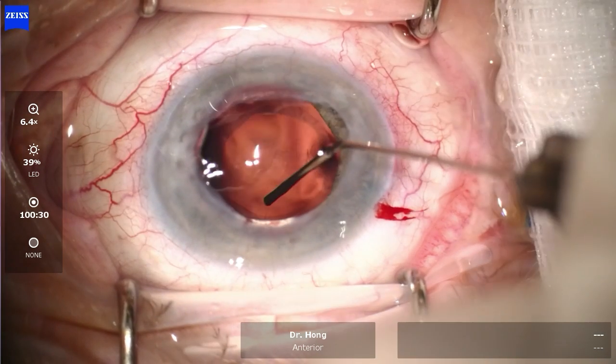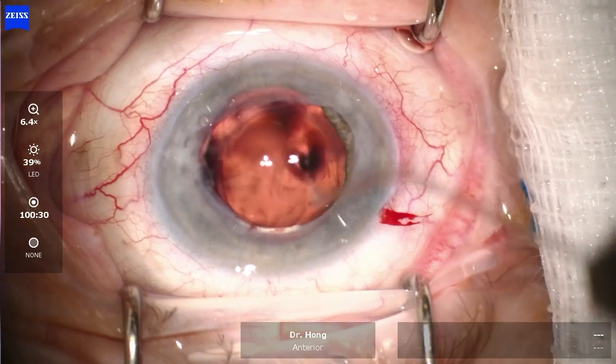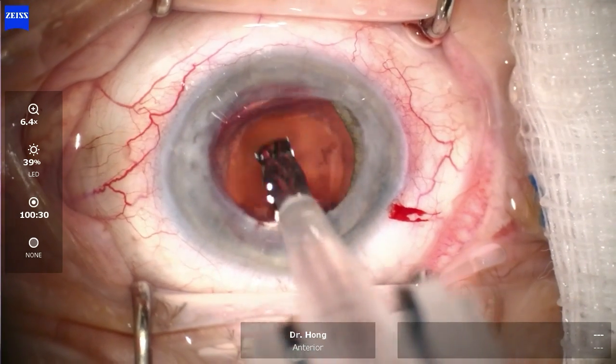Viscoelastic was then injected into the bag and a preloaded intraocular lens was placed into the bag.